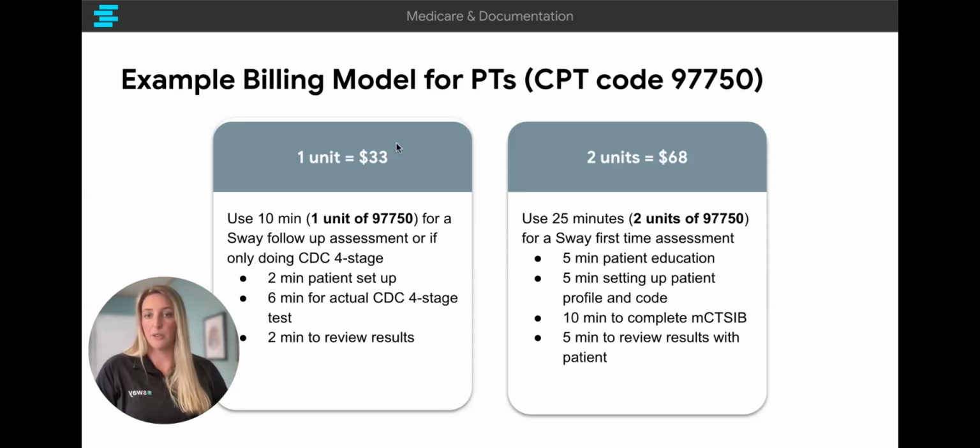But 97750 is a unit-based code, so that's where the timing of how many modules you administer, are you using the screen or the assessment? It's all time-based. So these are actual scenarios of times where I set up patients and the time it took me to set them up, review the results, administer the test. All of that is billable time, and these are a few examples of that.